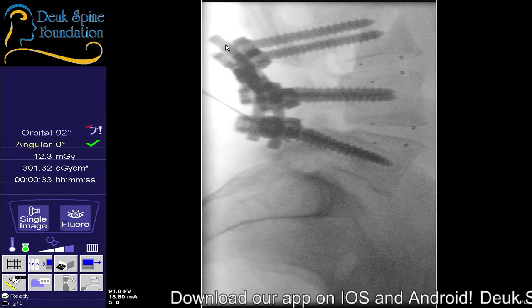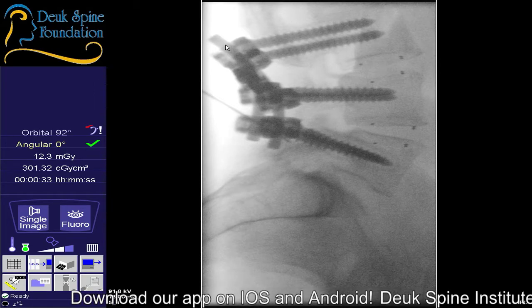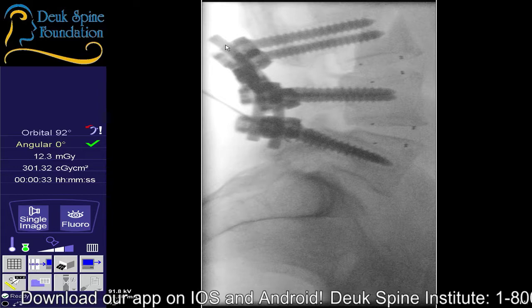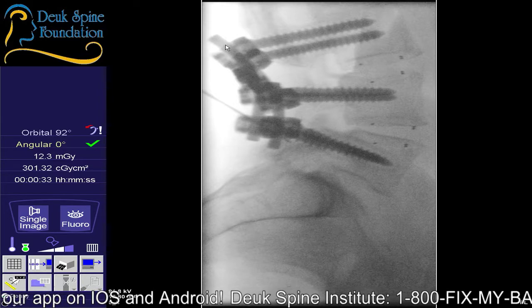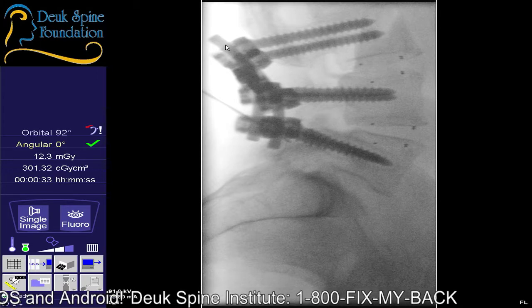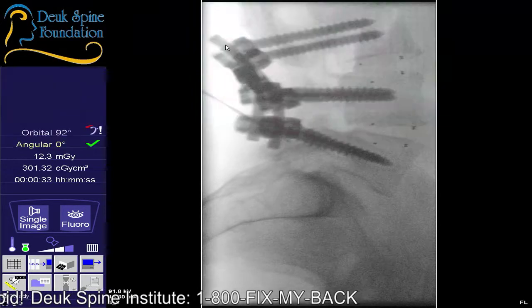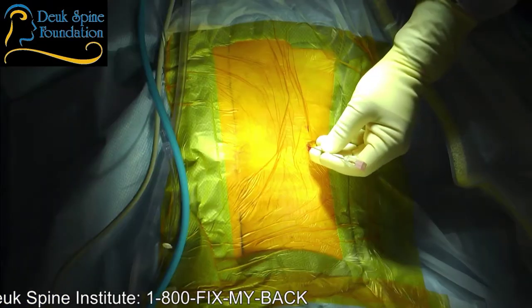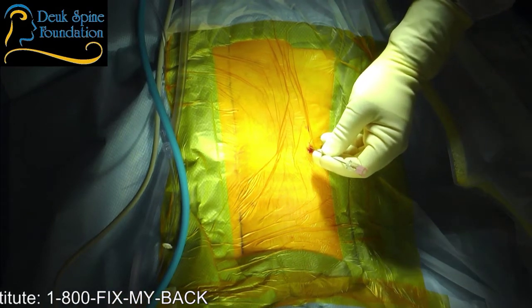You still have it going all the way down? Right now? Yeah. Yeah, we're actually not near your nerve, so maybe you're just tightening up. That may be part of the thing. Her muscles are pretty tight, so she's very anxious. I wonder if we can... I think we're okay for right now, actually. All right, let's see what I can do here. How's the blood pressure? I wouldn't go any higher than that.